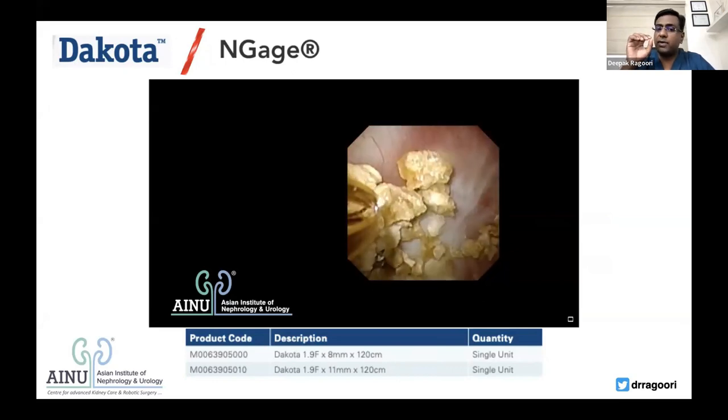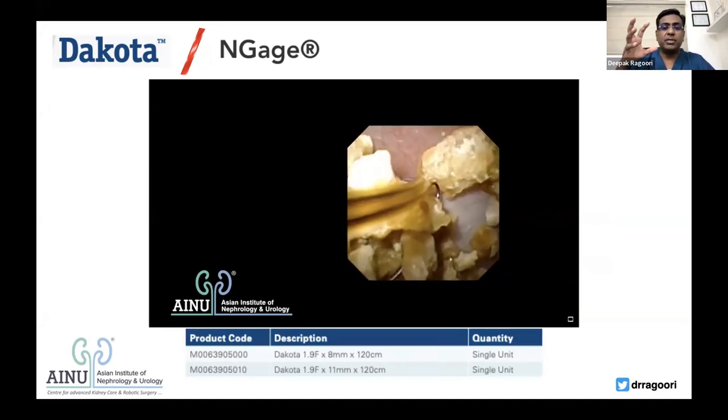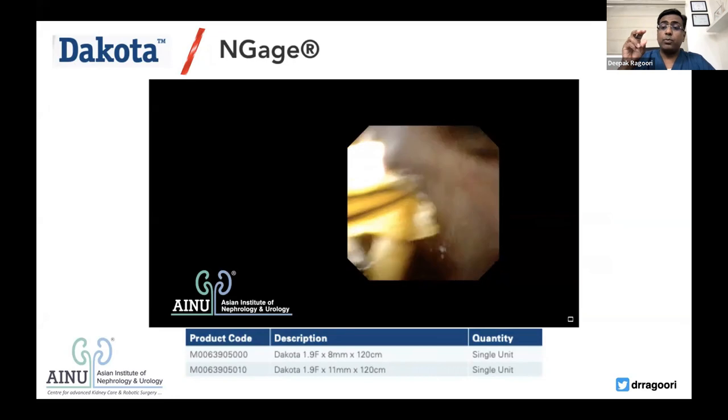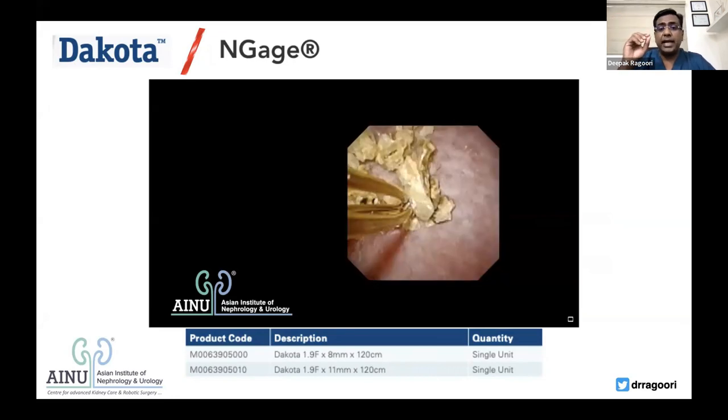You know, I can pick up a very small fragment. And in this case, now I would pick up a large chunk of stones. This is what I'm trying to impress upon. Open-end basket can open as wide as you want. In this case, 11 millimeters, or it can be only 8 millimeters.